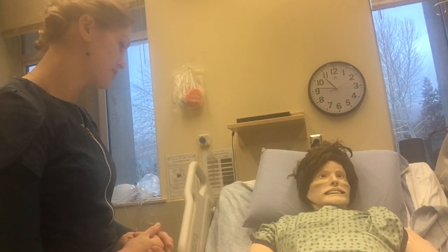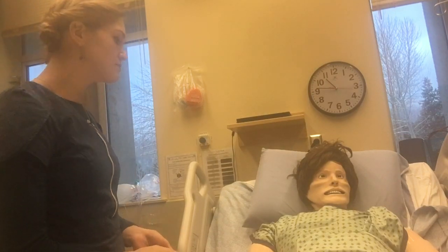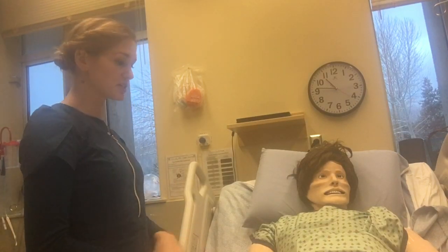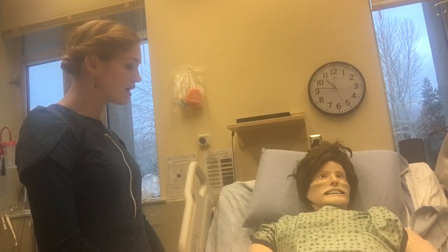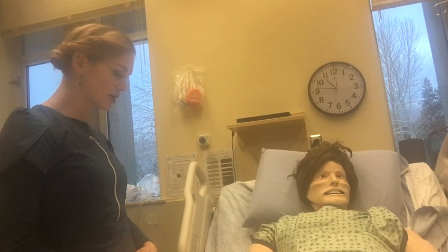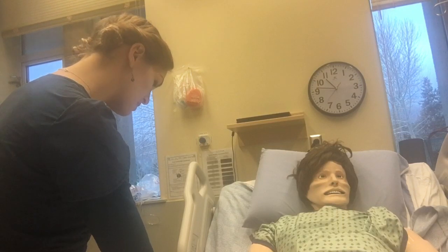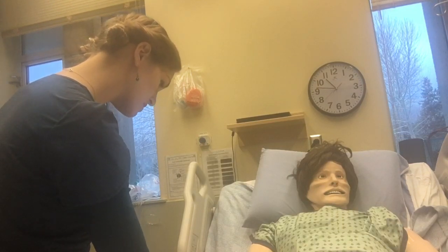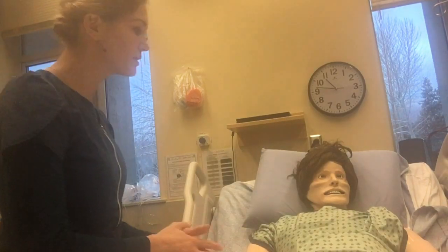I'm also going to be assessing her for any other factors that might be inhibiting her wound healing, such as comorbidities, her decreased mobility, her nutritional status, if she's a smoker, her age, anything like that. And I'm going to be asking her for her full name and her date of birth. Yeah, Kendall Barker, and your birthday was the 25th of June 1971. Good.